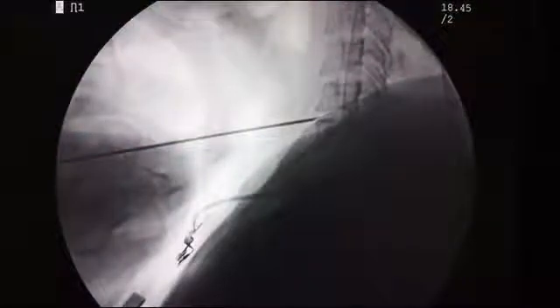Now we will see in the lateral view, we can see how the needle is slowly entered into the disc. In the same way, the C45 level is also done.